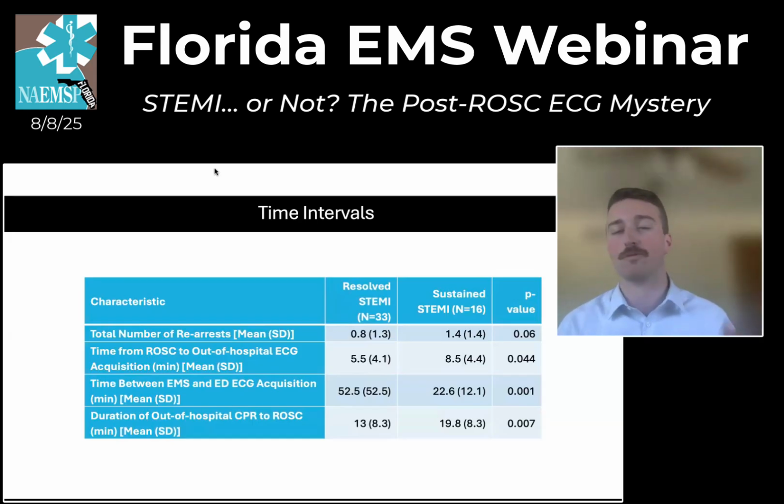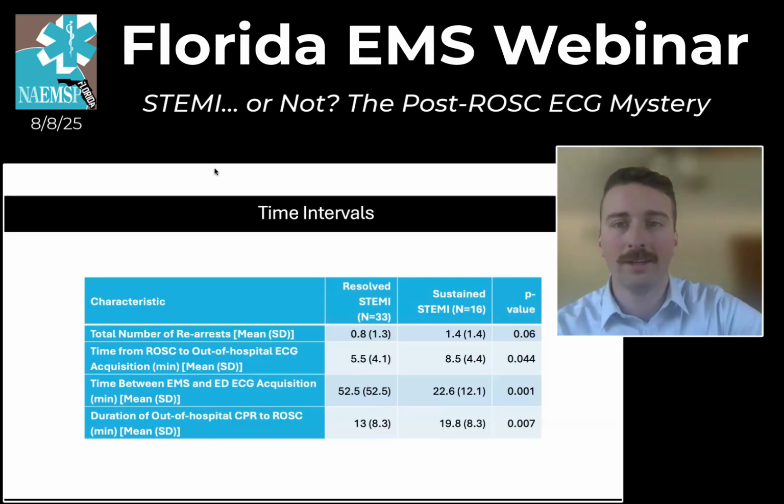So those would have likely been lumped into the ischemic. I think that reapproaching this kind of study using more expansive EKG diagnostic criteria, such as OMI, things in the realm of the Queen of Hearts algorithm, would really be an informative study, because perhaps some of these patients still had OMI diagnostic criteria, even though their STEMI criteria go away? And that's something I'm really curious to answer.